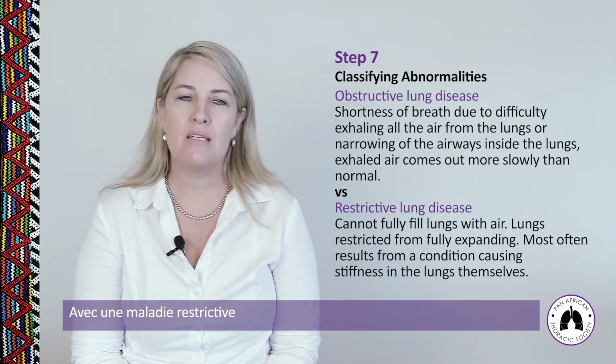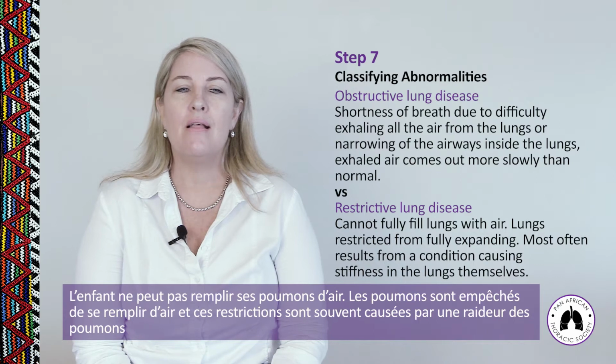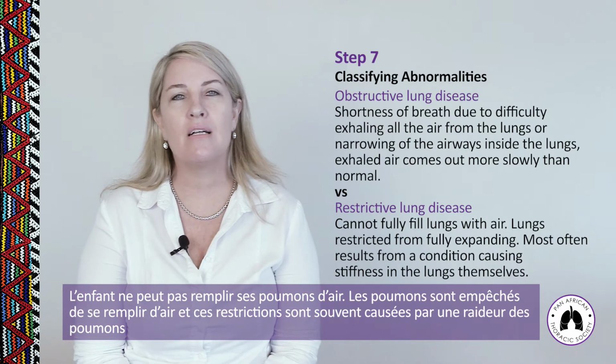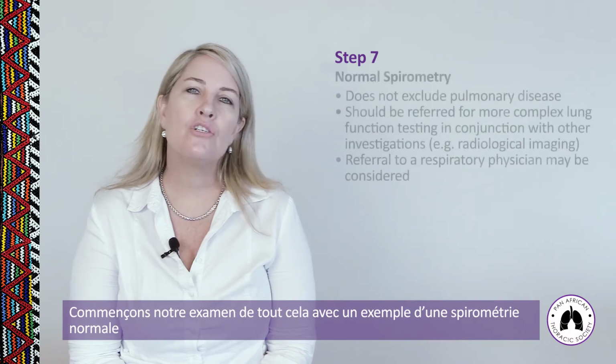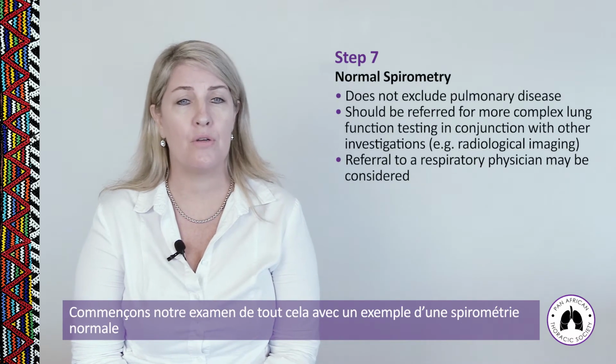In restrictive lung disease, children cannot fully fill their lungs with air. The lungs are restricted from fully expanding, and restrictive lung disease most often results from conditions causing stiffness of the lungs themselves. Let's start by looking at a normal spirometry result first.